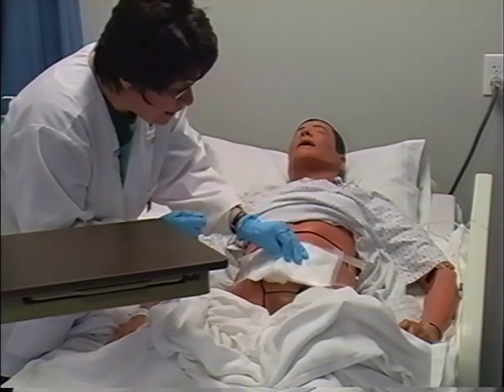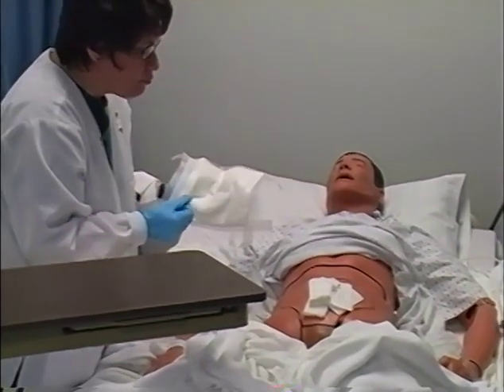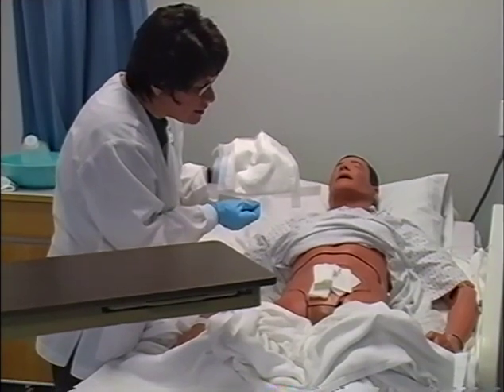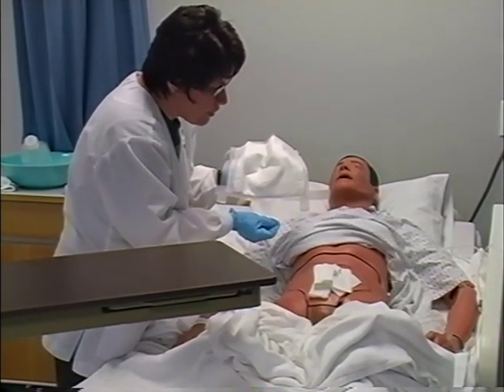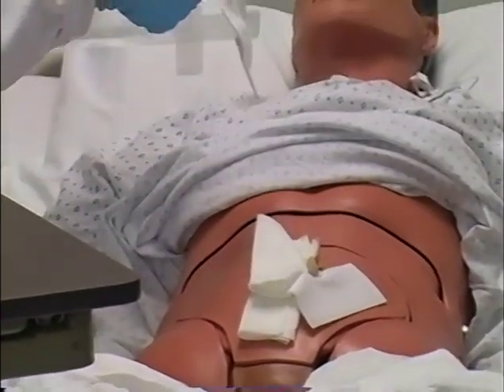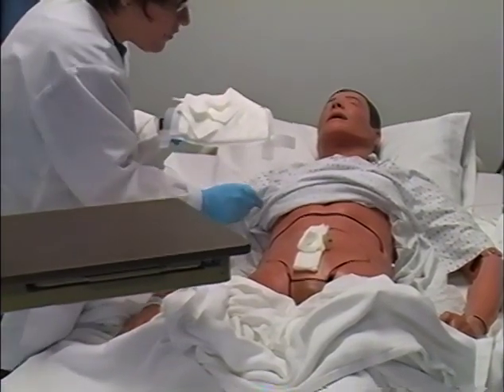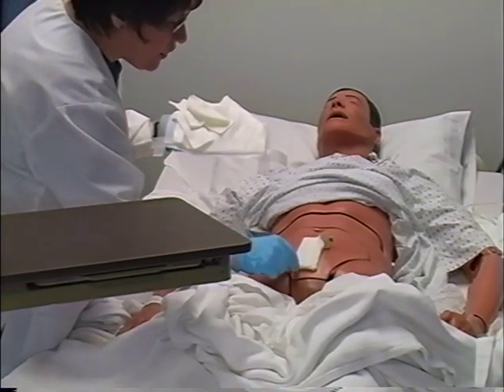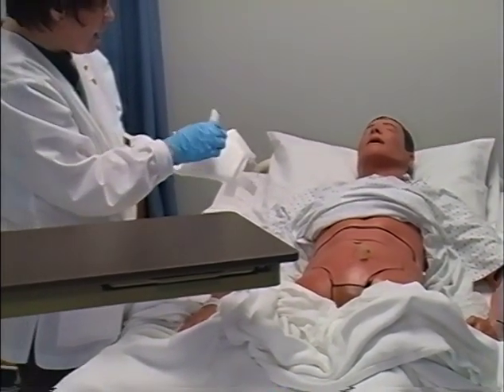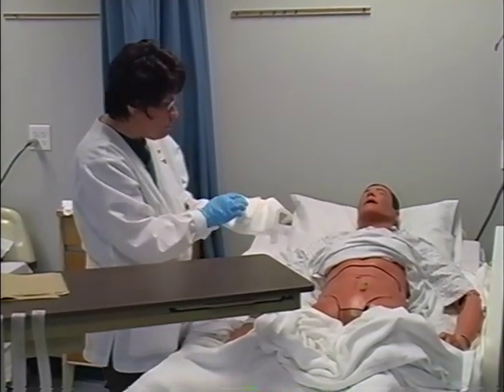To remove the old dressing, I'm going to grasp it in the center and lift it off. I've checked the chart and I know she has a Penrose drain, so I need to very carefully remove that dressing without pulling out or advancing the Penrose drain. I can see there's absolutely no drainage on the abdominal dressing. My next step is to study the sterile surgical site, and I need to remove the remaining gauze by touching only the outermost corner, so I'm never reaching over her incision or over the drain. I can see she had a small amount of sanguineous drainage on the 4x4s right over her incision.